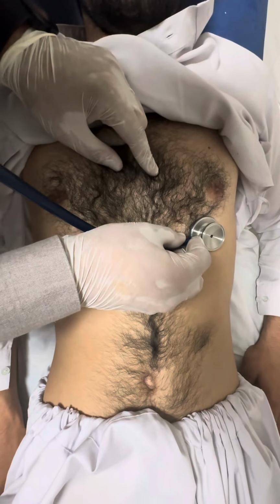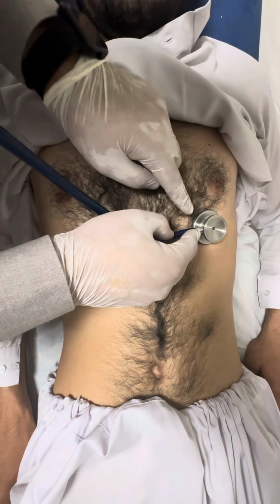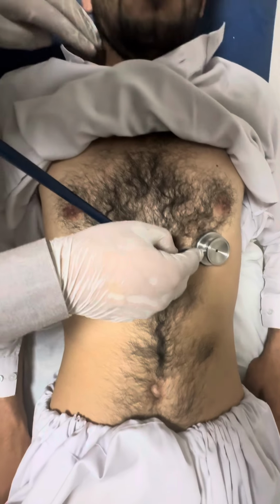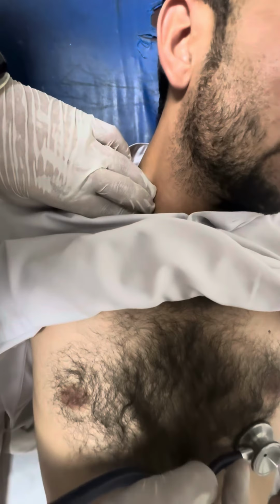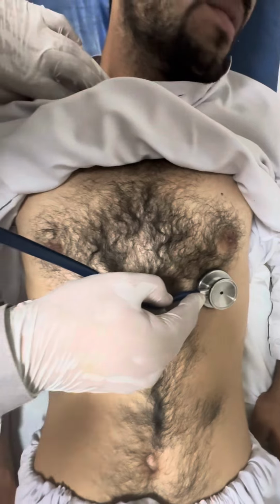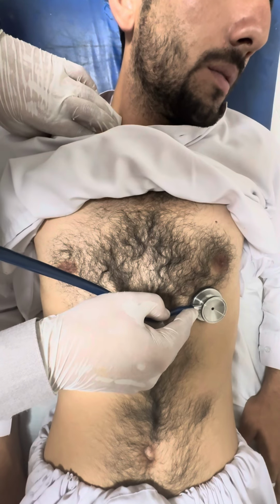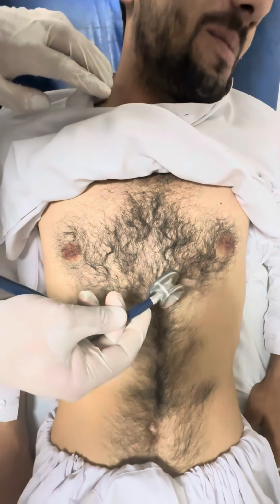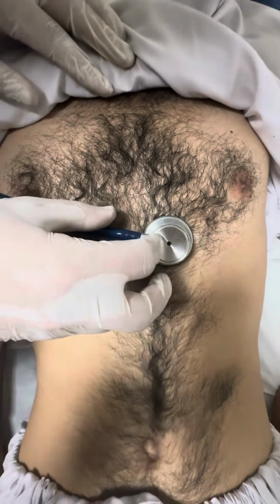So here we will auscultate the mitral area with the stethoscope, and at the same time we will palpate the carotid pulse for S1 and S2. We will go to check for murmur, and then we will localize the murmur site, nature, and radiation in relationship with respiration. Now we will auscultate the tricuspid area.